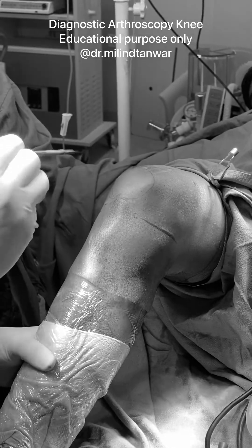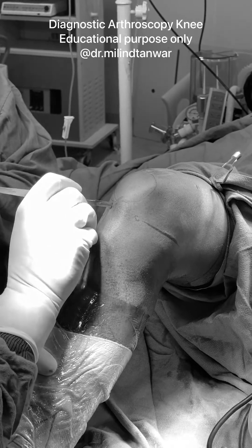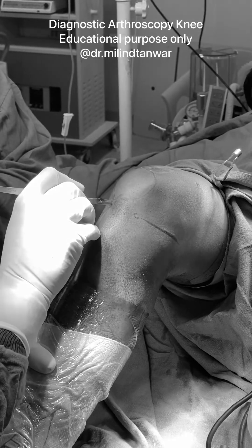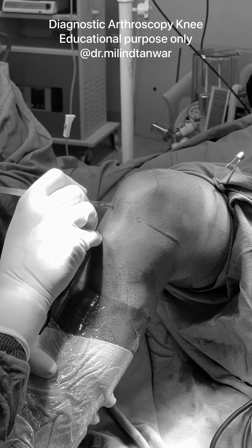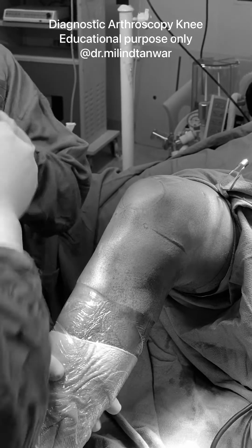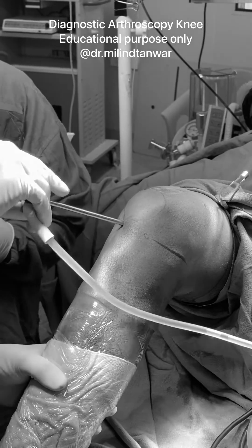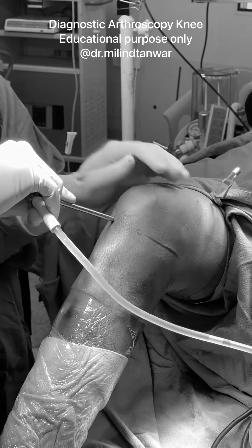Go in wherever you find the soft spot. You have to go vertical while on the lateral side, and it has to be a deep single stab. You have to come out in a single stick. The very important step is that you should not rotate the blade inside the joint.